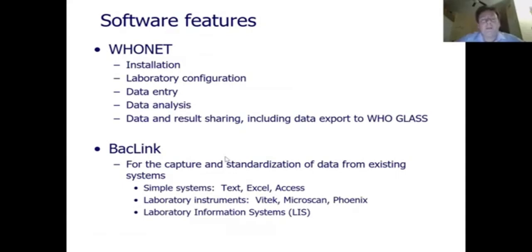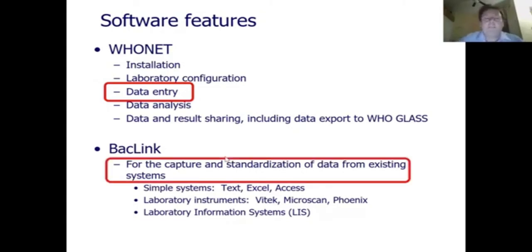First of all, WHONET. As I mentioned, we'll talk about how to install WHONET onto your computer, how to configure WHONET for use in your laboratory, data entry, data analysis, data and result sharing, including data export to GLASS. So we'll focus in this presentation on WHONET manual data entry, as well as BacLink.